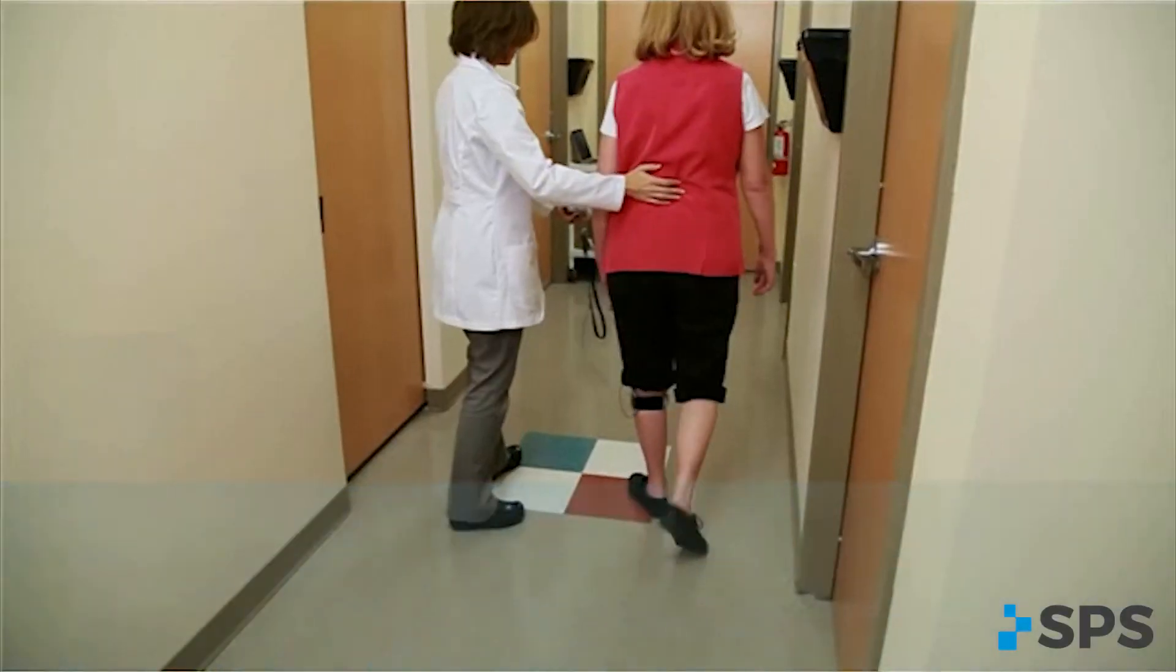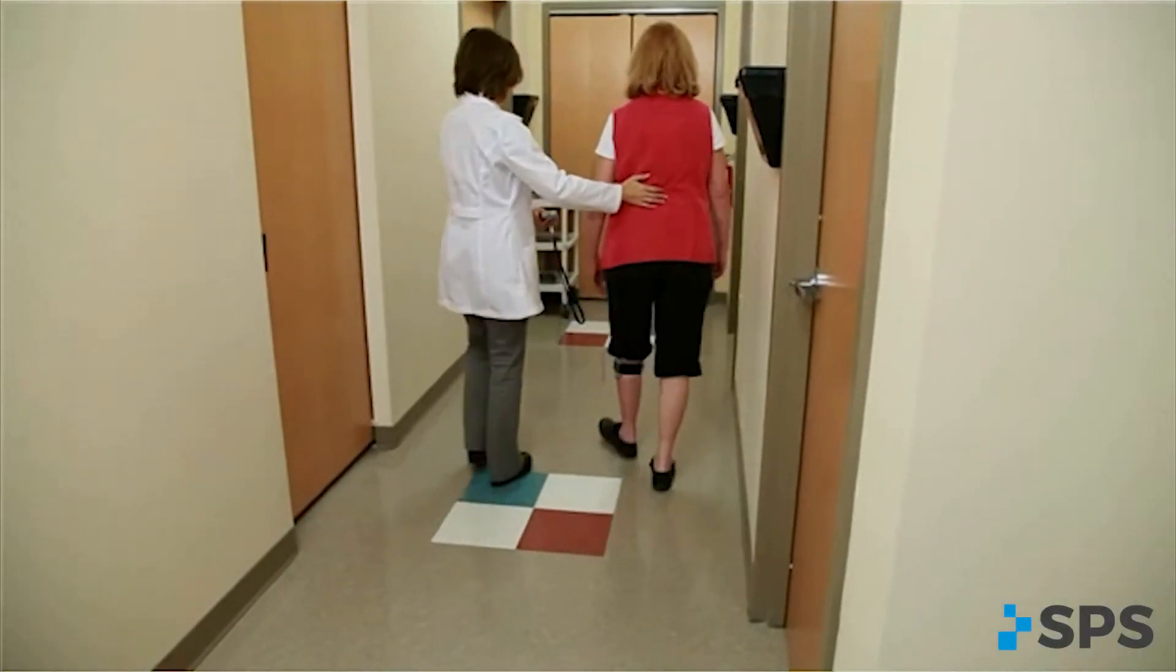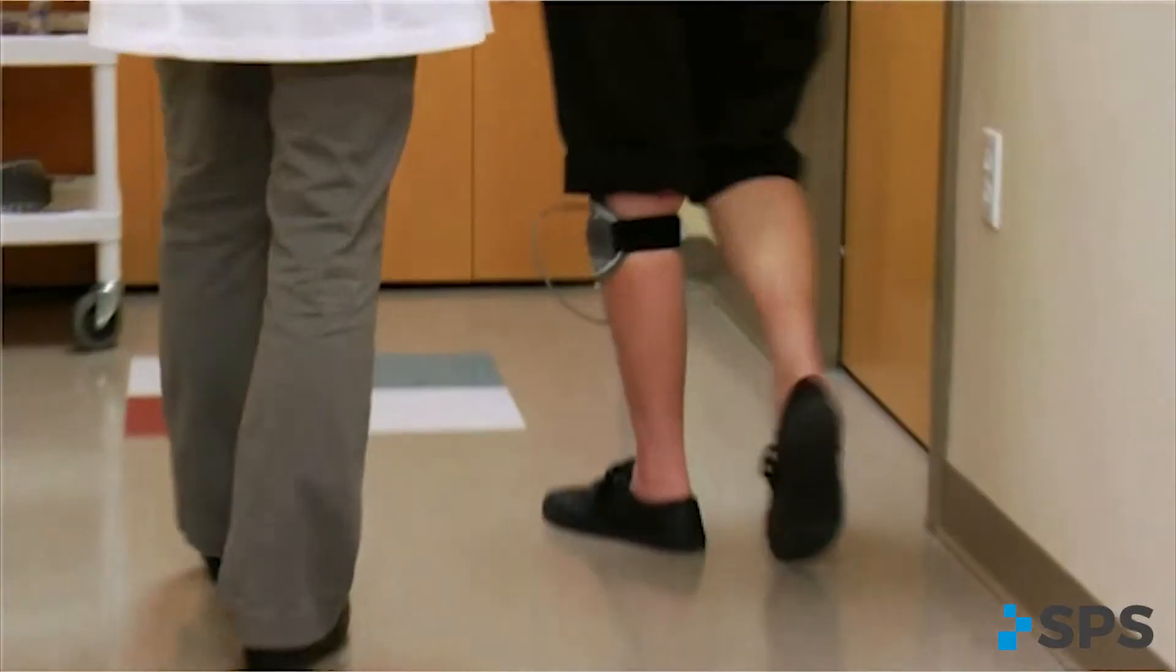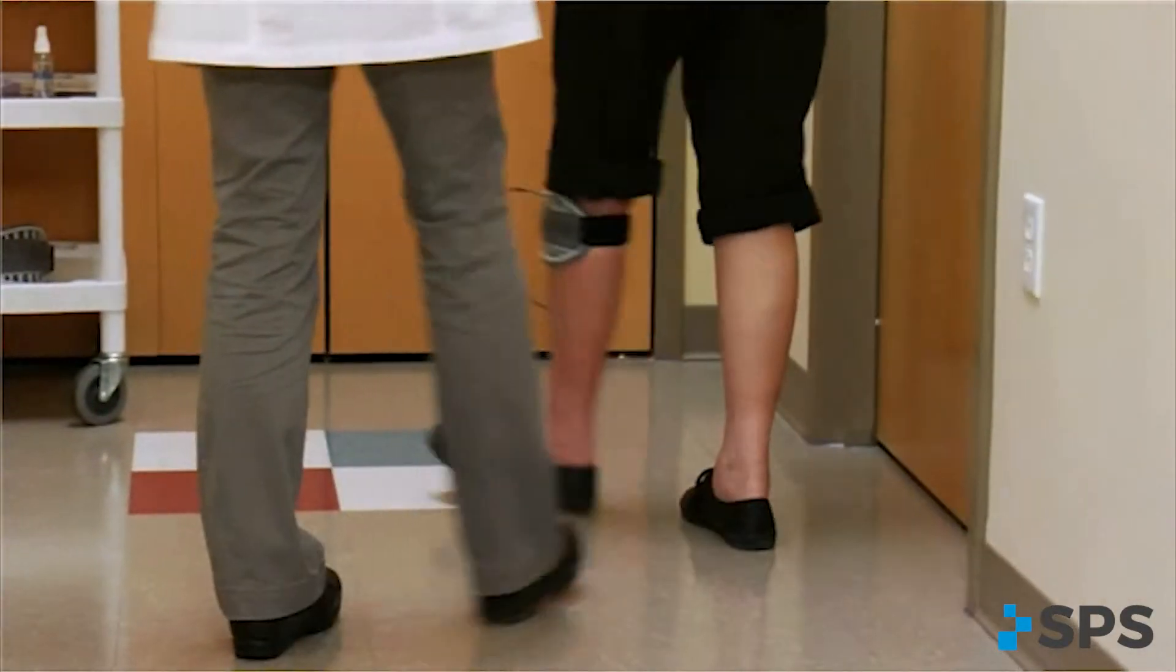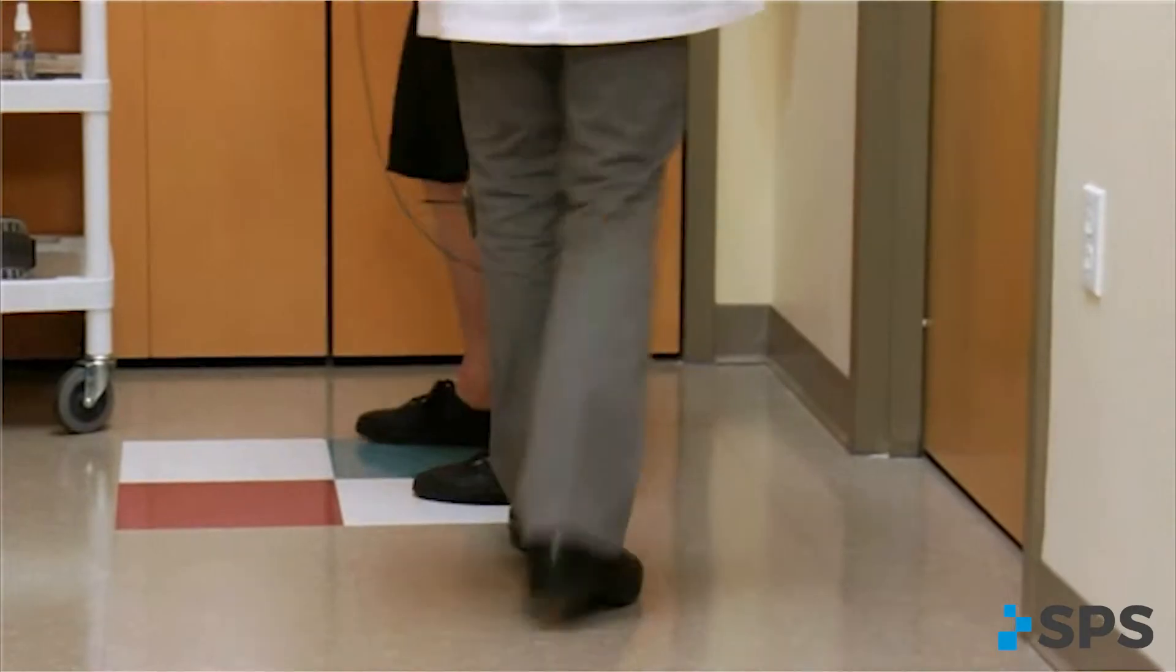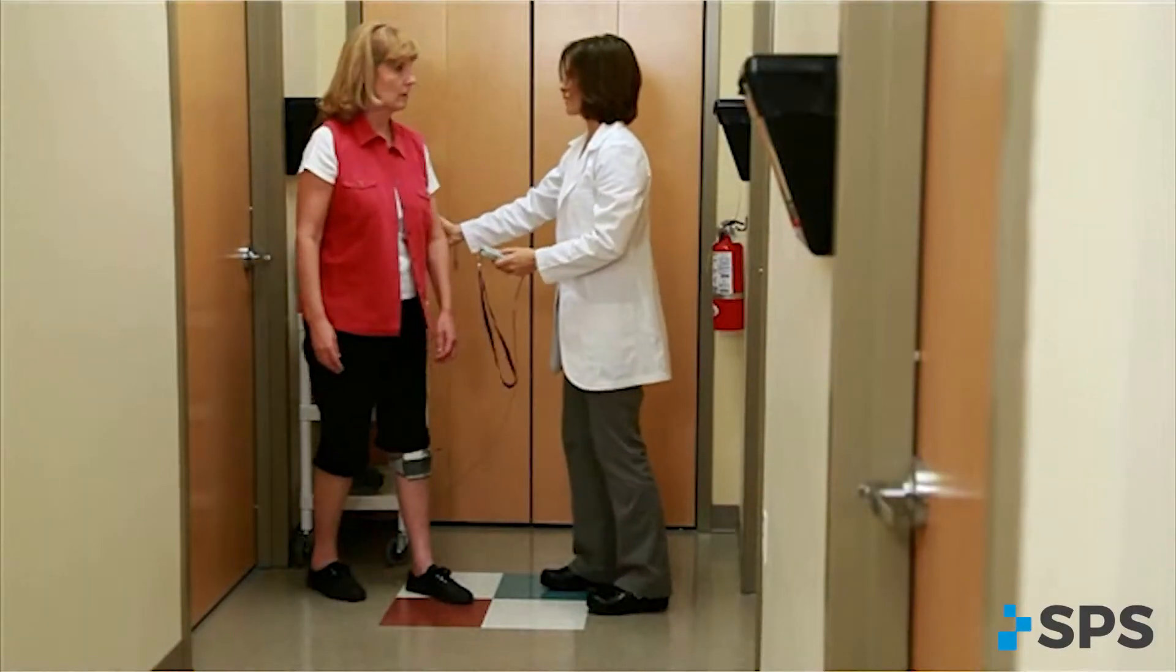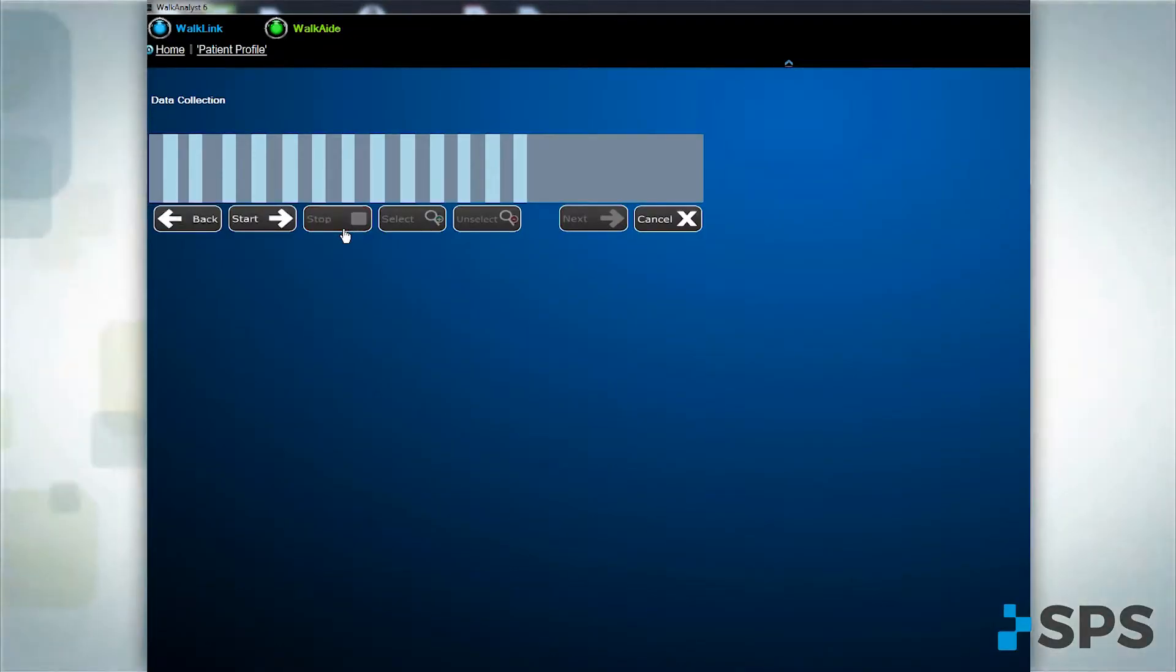You will begin stimulation at the appropriate point between heel off and toe off, and maintain stimulation through heel strike. At the end of walking data collection, click stop.